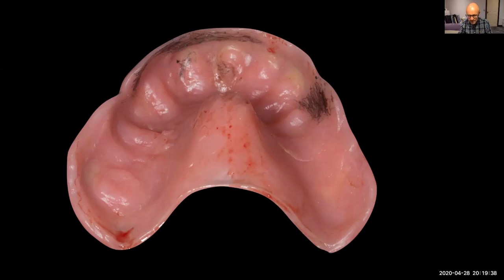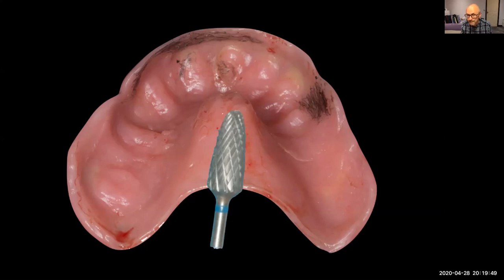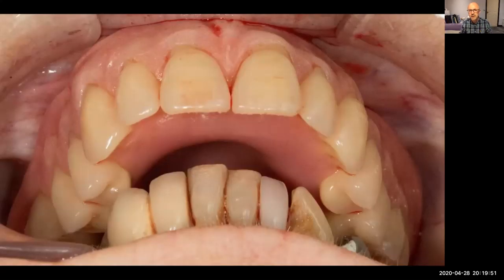And doing this really helps with reducing the sore spots. So I just go to those spots with a tungsten carbide drill, and then we just repeat it until it's a nice even layer. So that's number one.